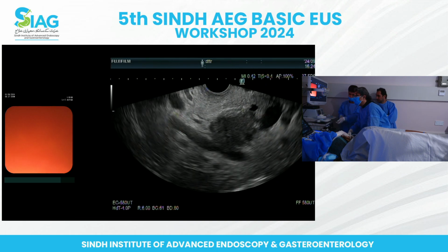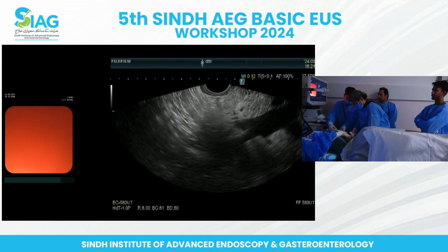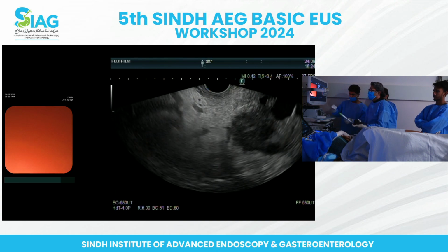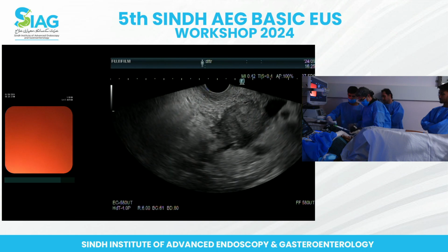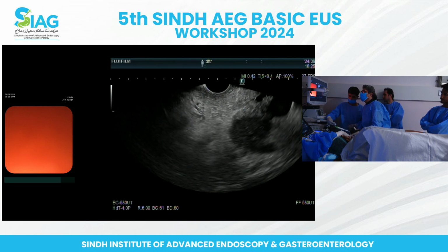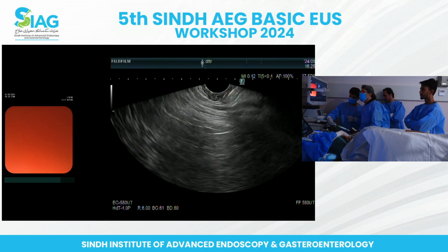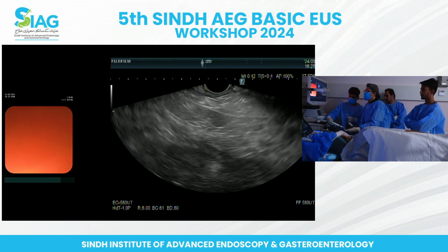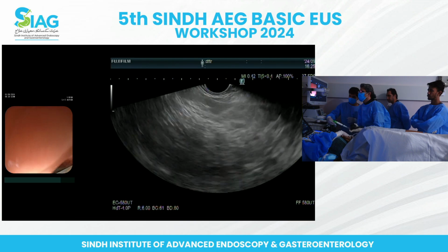So let me just do this one. Now we've lost it, haven't we?